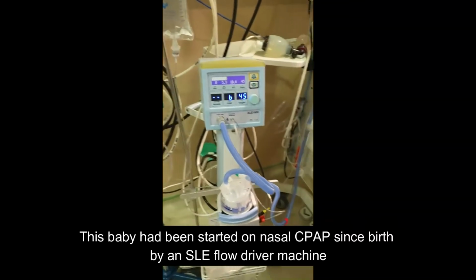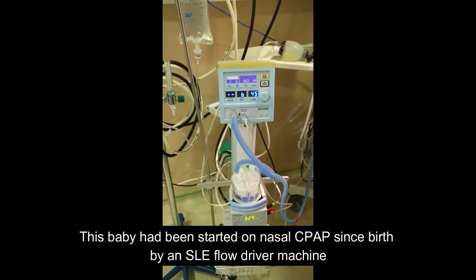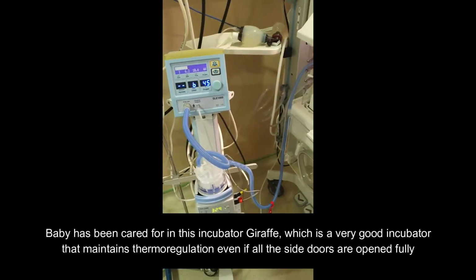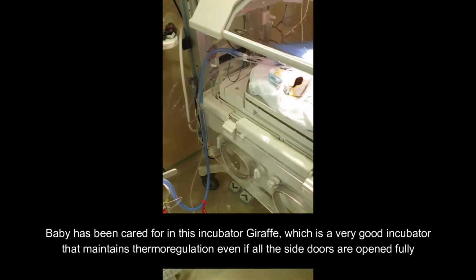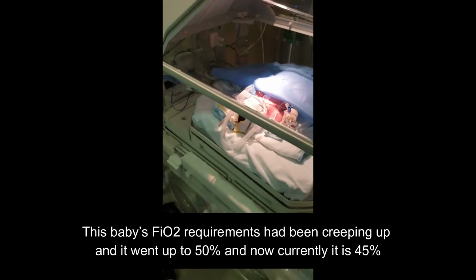This baby had been started on nasal CPAP since birth by an SLE flow driver machine. The baby had been cared for in a giraffe incubator. It's a very good incubator that maintains the thermoregulation of these babies even if all the side doors are open fully, as there is a thermocurtain.